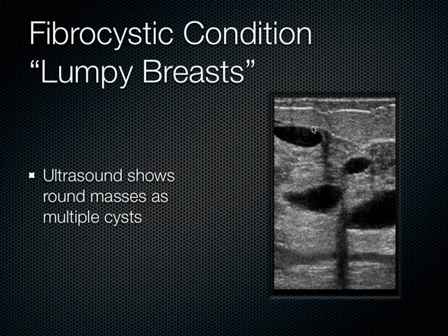And so it goes through here, and then it gets redirected. And on the edges of that cystic structure, we get these lateral shadows. Sometimes we call it lateral cystic shadowing, or refraction artifact. The sound is being redirected. So that's why we see these shadows here on the edges of these cystic structures.